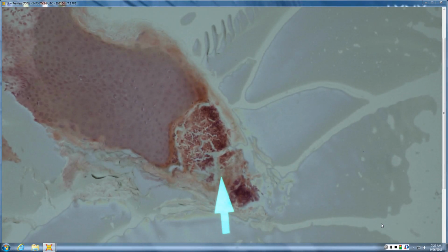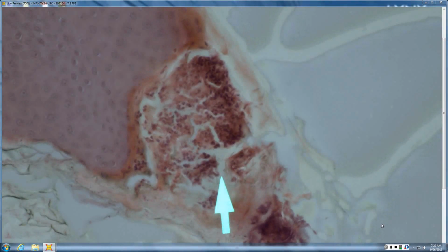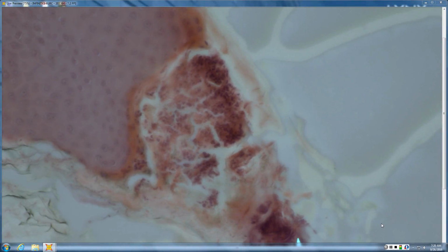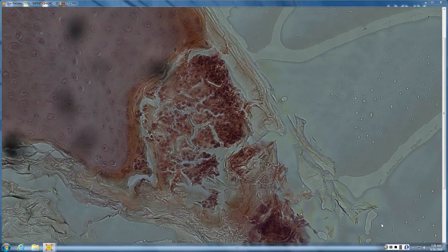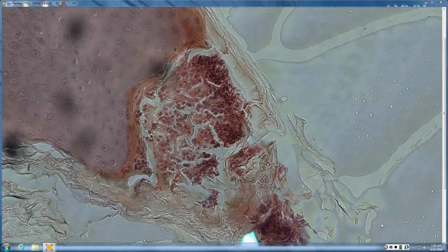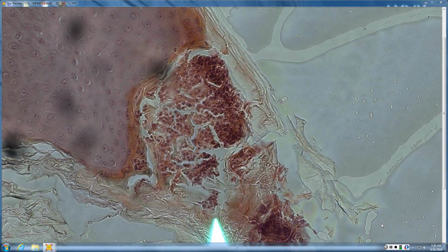And if you look down in here even closer, you don't want to stain this, but you'd actually start to see little pseudohyphae and spores and whatnot. Actually, if you put down the condenser, you can almost see it a little bit better. Kind of see in here little pseudohyphae and spores and whatnot. Just use your imagination. They're there. That's candidiasis. Subcorneal pustule.